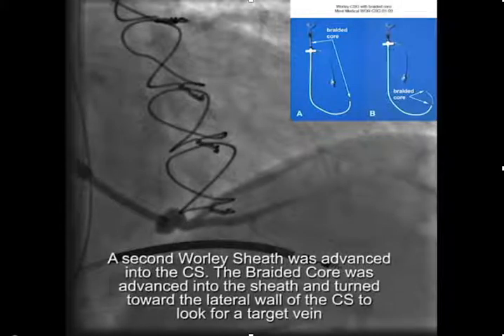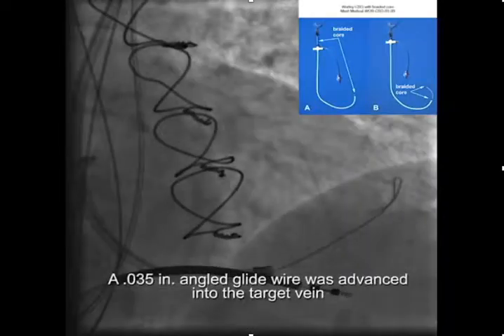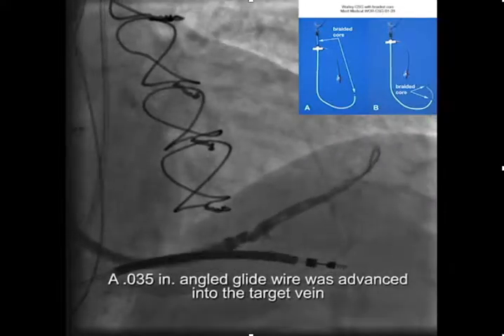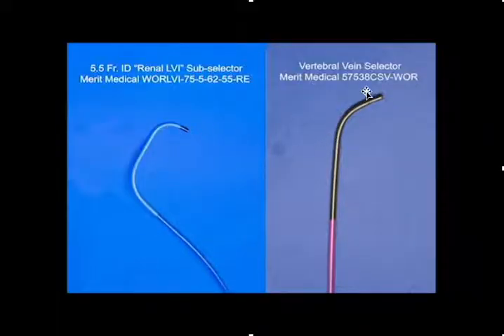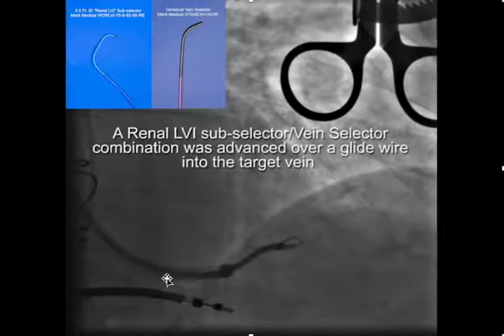The takeoff looked a little tricky but we were able to advance an 035 inch angled glide wire into the target vein. Here's the whirly sheath and here's the tip of the braided core. We then removed the braided core and took a vertebral-shaped vein selector, inserted it into the 5.5 French lateral vein introducer subselector, and slid that over the glide wire with the support of the sheath.